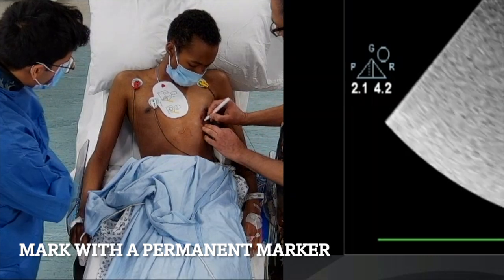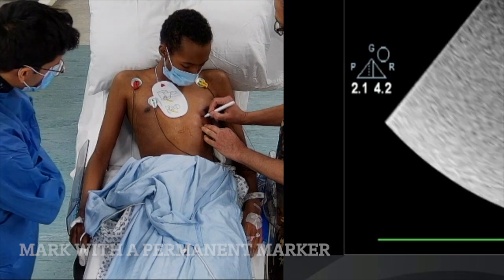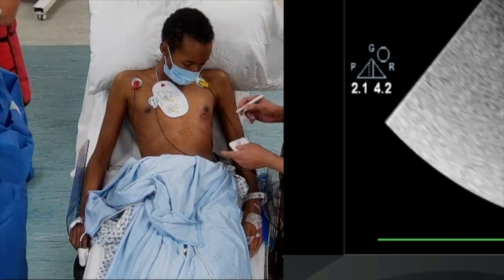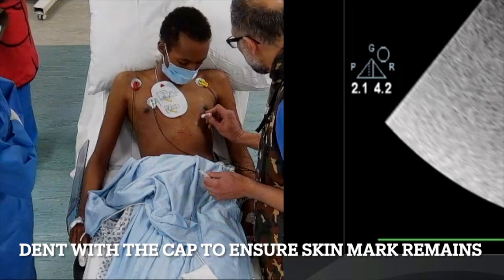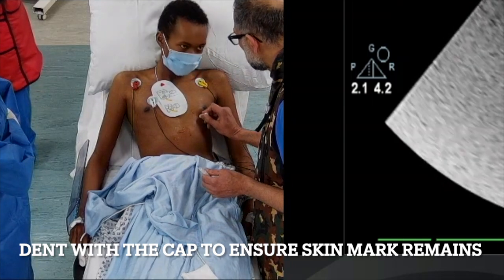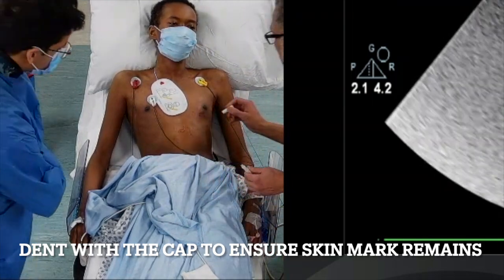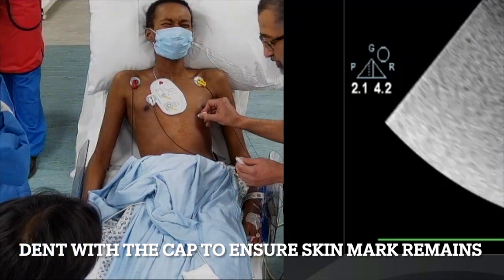The marker often rubs off, so once I've applied a generous amount of marking, I'm also going to use the cap of the marker pen to indent the skin. If you push in firmly it leaves an indent in the skin — not too painful — but it means that if the marking rubs off, you'll still be able to see where your needle has to go.